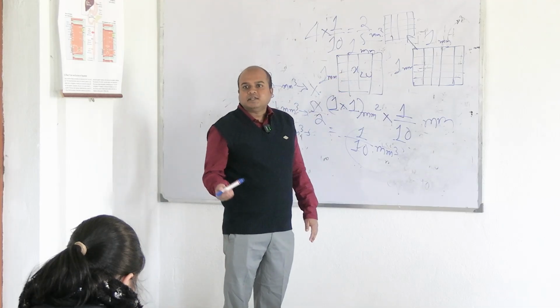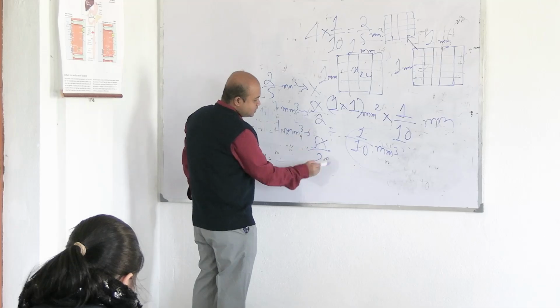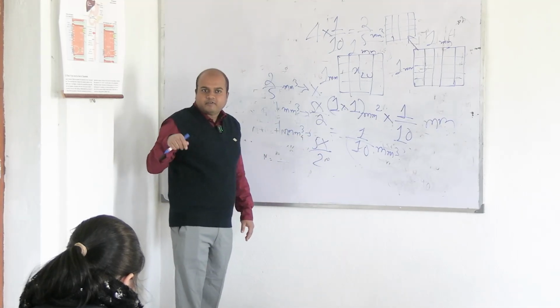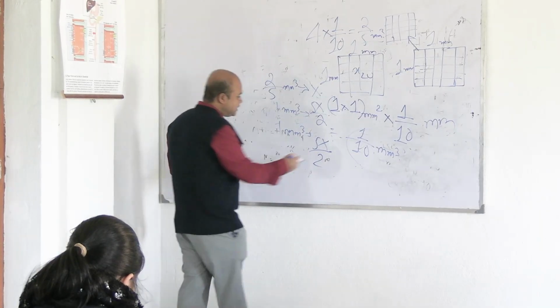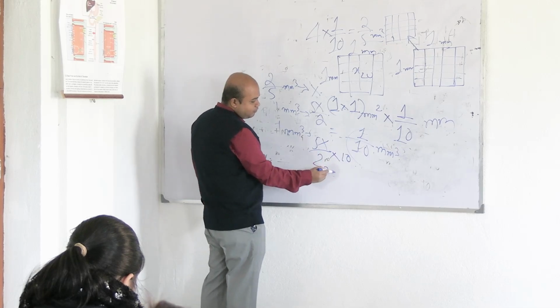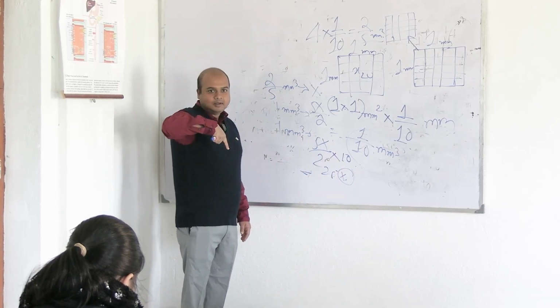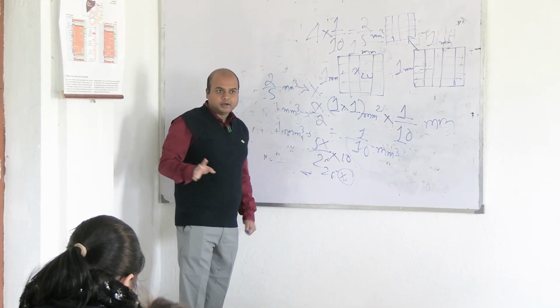If the dilution is 10 times only, say we have taken blood up to 1 and then taken fluid up to 11, then the dilution will be 11 minus 1 by 1, because blood is 1 portion. So it is 10 times. So the final calculation will come like 25x, but actually that x is double of what it is by diluting 20 times. Have you got it?